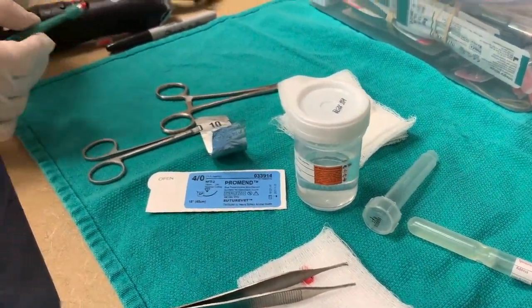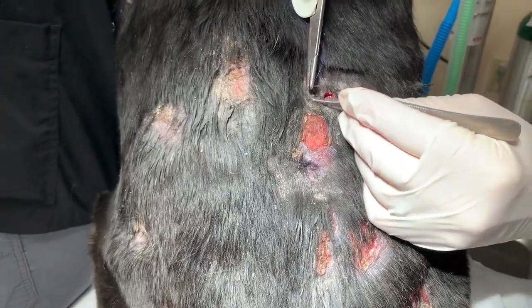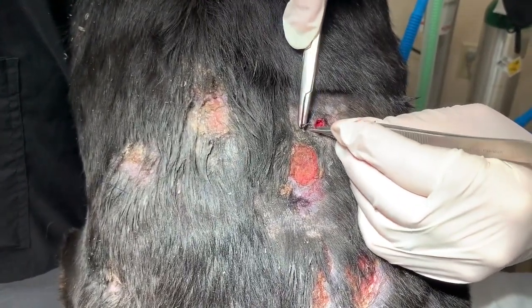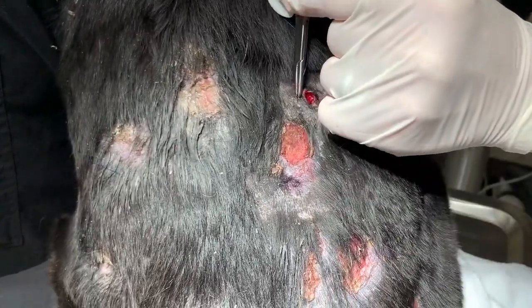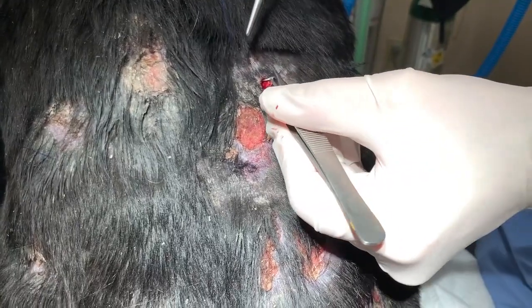Then we'll get our other two samples in the same way. To close, you can put in one or two simple interrupted sutures or a cruciate suture.